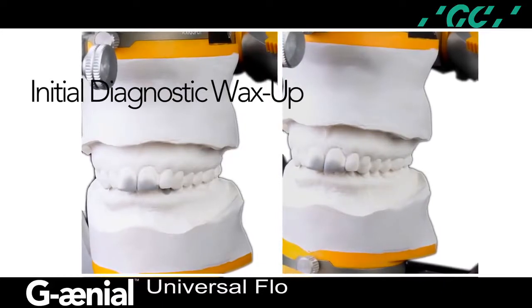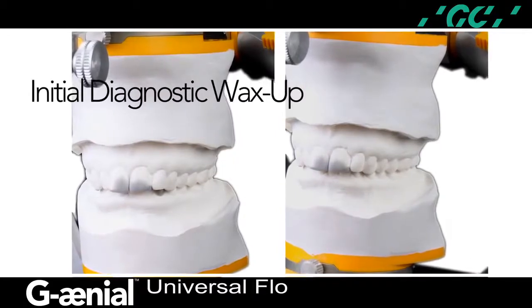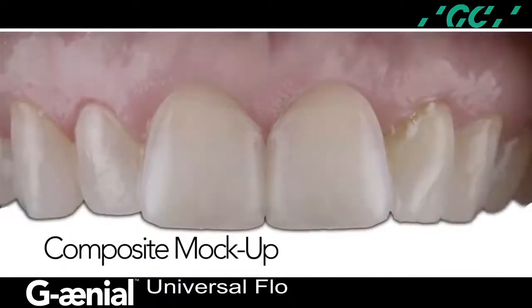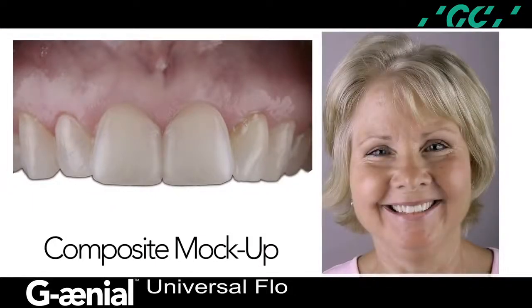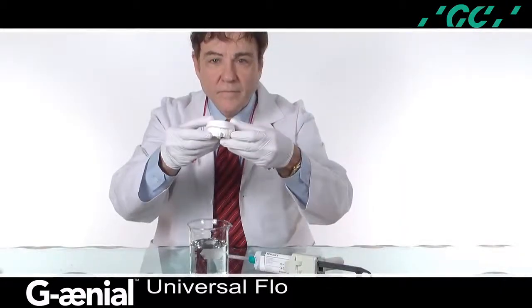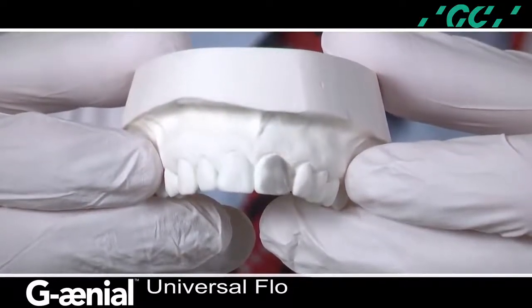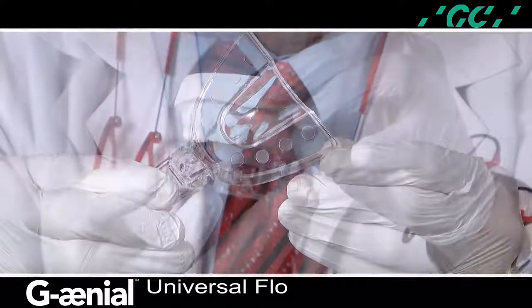Two initial diagnostic wax-ups were designed to evaluate form and function, and if this wax-up is precise, it can be translated using this technique for an immediate visualization by the patient and the restorative team. The initial diagnostic wax-up was translated intraorally with flowable composite Genial Universal Flow for an immediate evaluation, modifications were completed, and an impression was made. On the second model, a diagnostic wax-up was performed to change the shape of the maxillary left central after review and discussion with the patient and the restorative team.